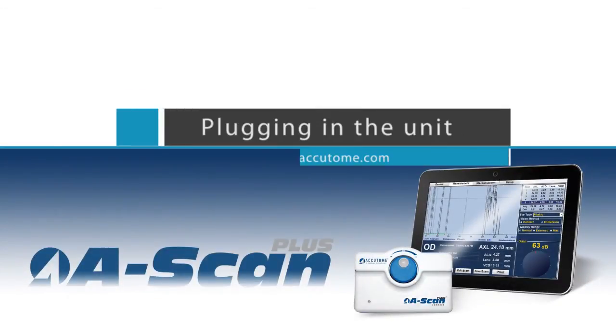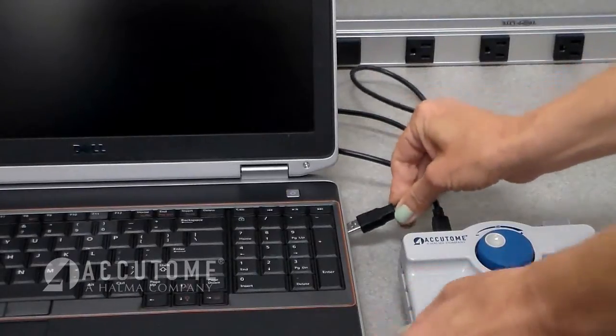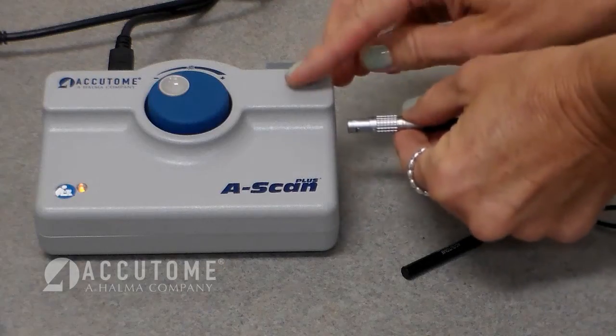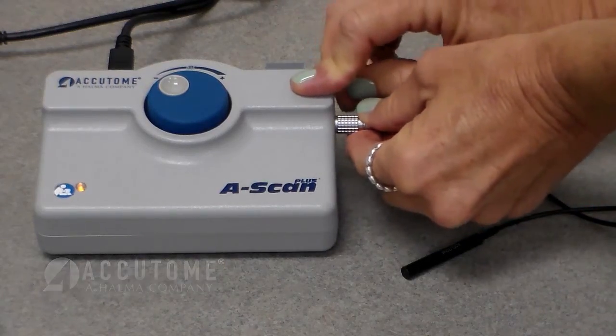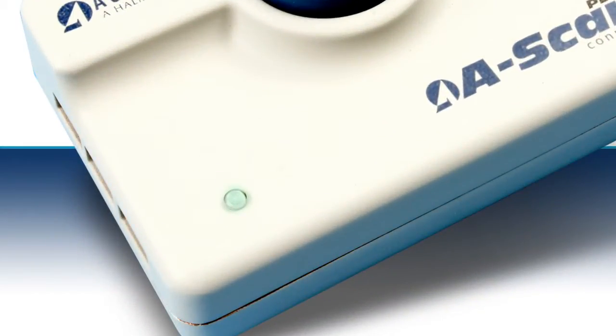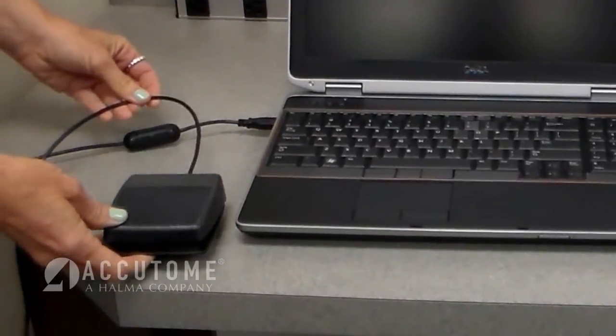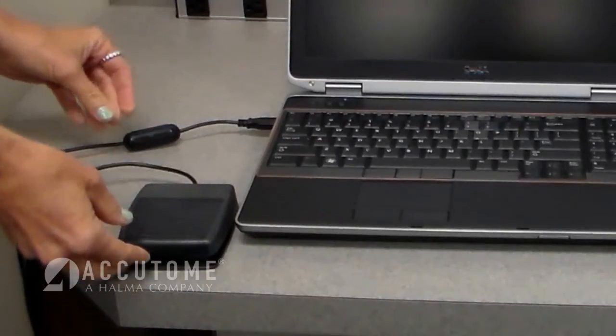Plugging in the unit. Once the software is installed, attach the USB cable to the ASCAN Connect and computer. Connect the probe to the unit. The ASCAN control unit may take a few moments to install. The light on the unit will turn green when the unit is ready for operation. If desired, the USB footswitch can also be connected to the computer.